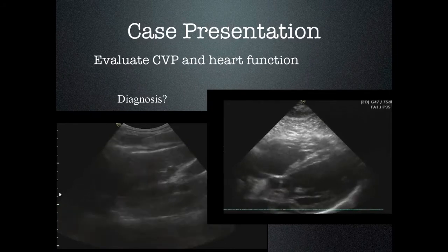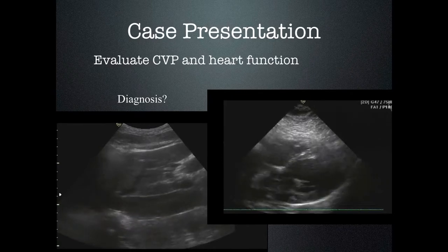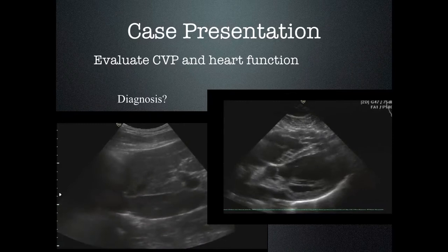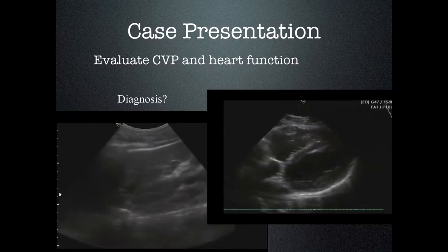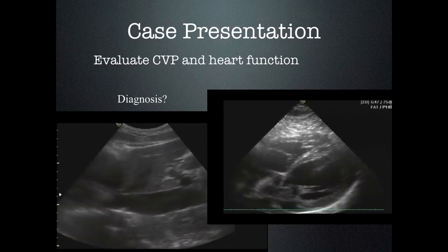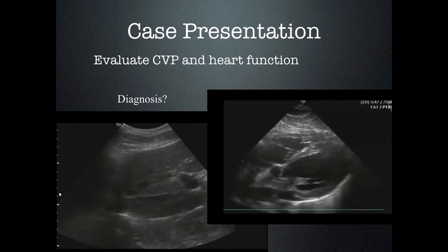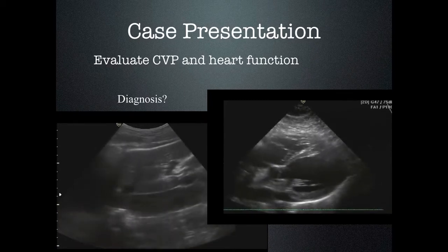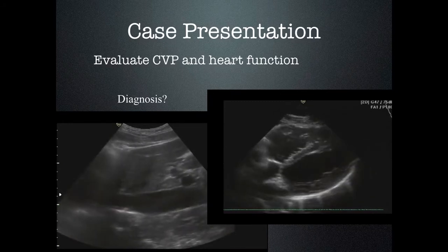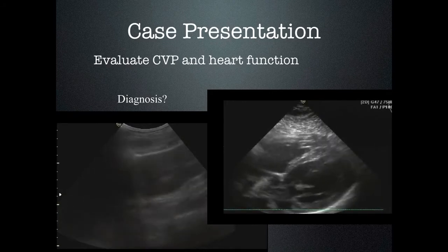One of the problems with thoracic ultrasound is people try and take it in isolation. You should always integrate the thoracic ultrasound into your clinical acumen. So ultrasound has 3 components: image acquisition, image interpretation, and then clinical integration. You can't use one ultrasound image to put all of this together in isolation. You have to ask the patient questions, you have to know a little bit about the patient, then you may have to add other ultrasound exams to increase your sensitivity as well as your specificity.